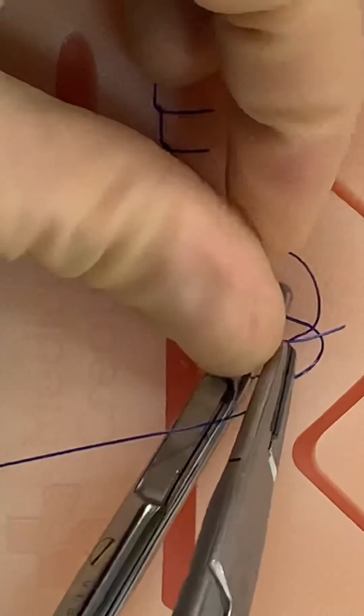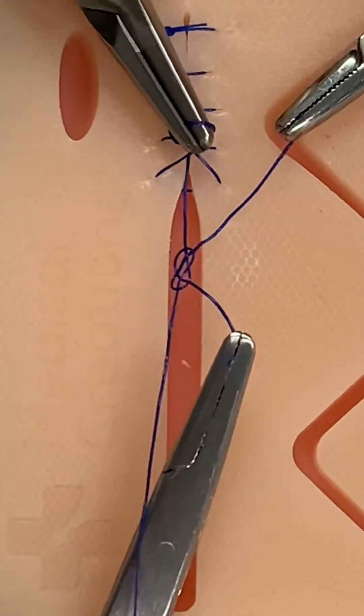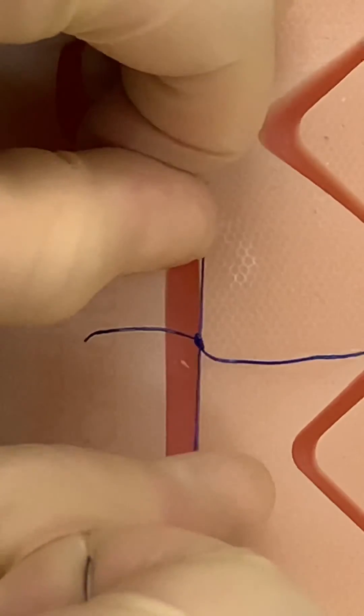Then thread the end through this new loop to form a second fish that's facing the opposite direction to the first. The knot is tightened by pulling the new and old suture ends in opposite directions.